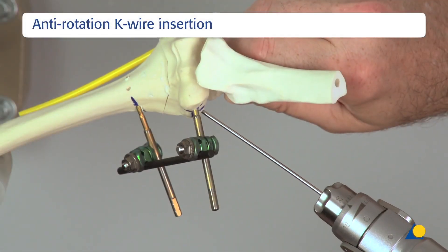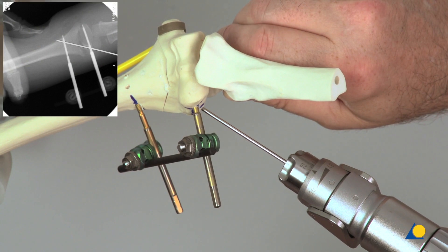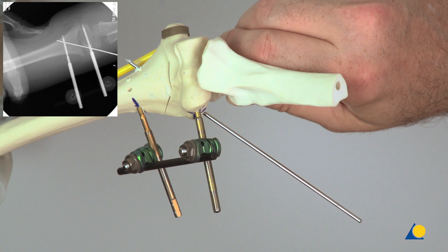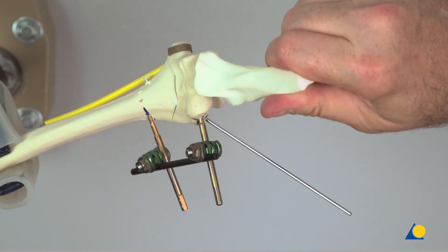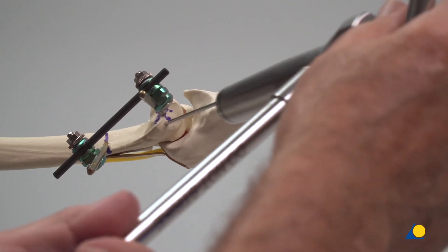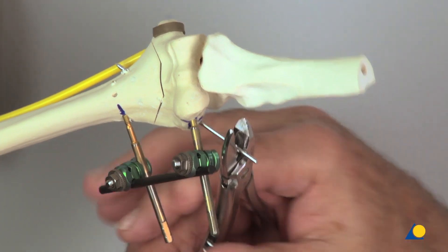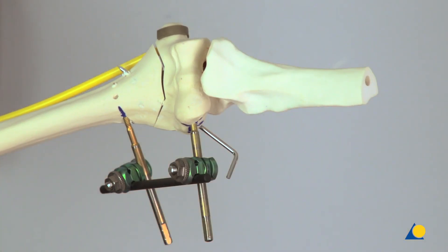To prevent rotation of the distal fragment around the shunt's screw at the fracture site, a 2.0 mm K-wire is inserted from the distal lateral aspect, posterior to the distal shunt's screw, towards the proximal medial cortex of the humerus, ending anterior to the proximal screw. The function of the anti-rotation K-wire is demonstrated here: the distal fragment is well secured and can no longer be rotated. The K-wire is trimmed using a cutter; the protruding end of the wire is bent towards the fixator to prevent soft tissue injury in the post-operative period.